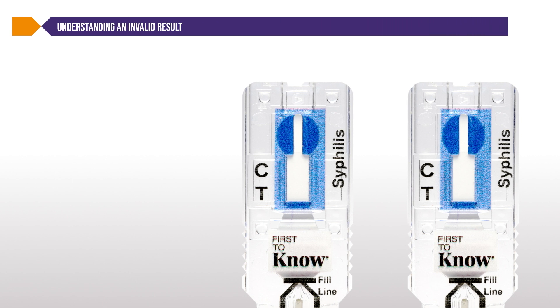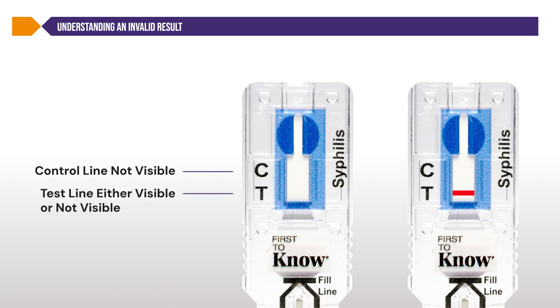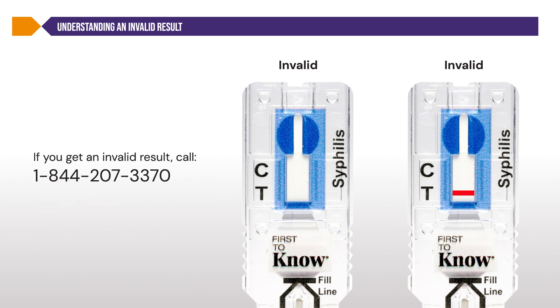Understanding an invalid result: there are two situations that result in an invalid test. If the control C line is not visible, regardless of whether the test T line is visible or not, the test is invalid. This means the result cannot be interpreted, and the test did not work properly. If you get an invalid result, please call our toll-free number at 1-844-207-3370 for assistance.